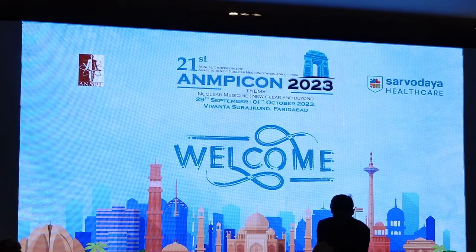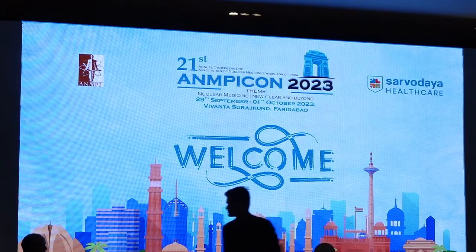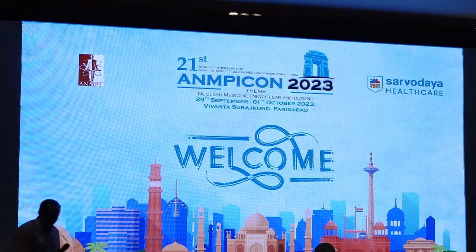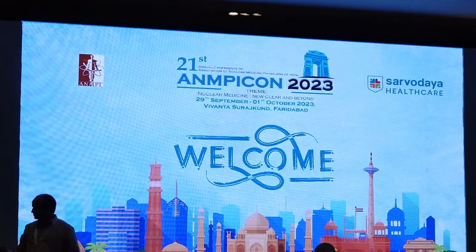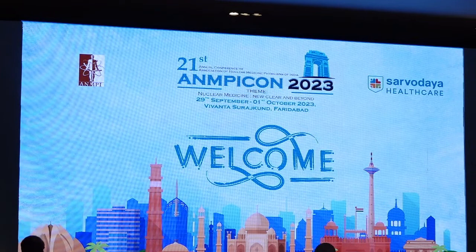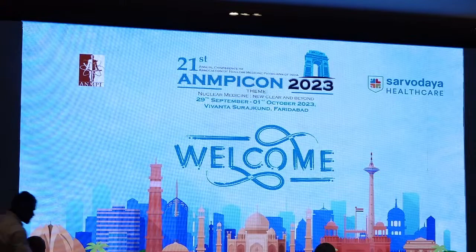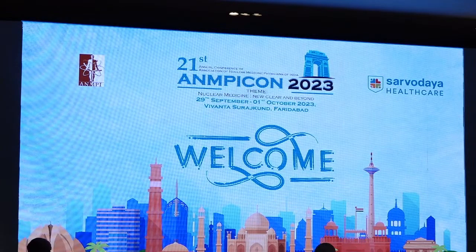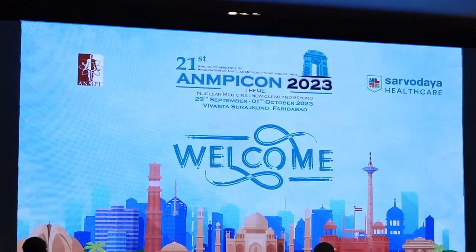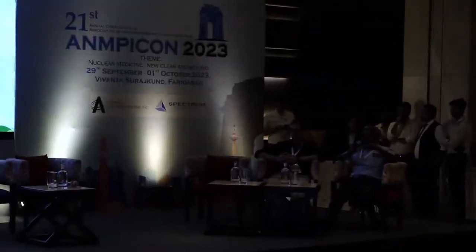Just a query: are all of these done Robio guided? Because most of the images were freehand. Sir, we are doing robotic arm guided also, we are also doing under fluoroscopy, and we are also doing freehand. With the Robio, I think one issue is respiratory motion and patient motion, because we have tried them and the lesion is very small.